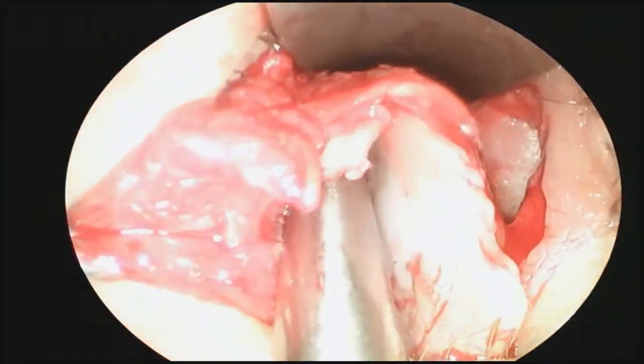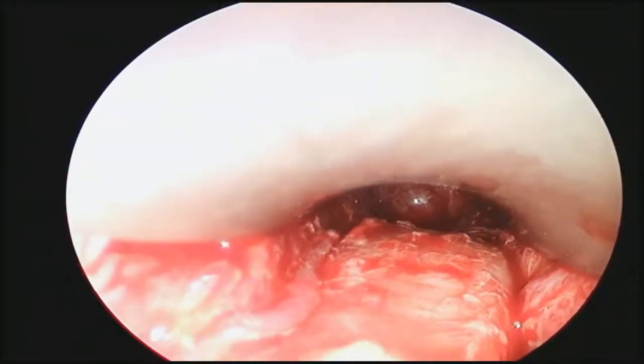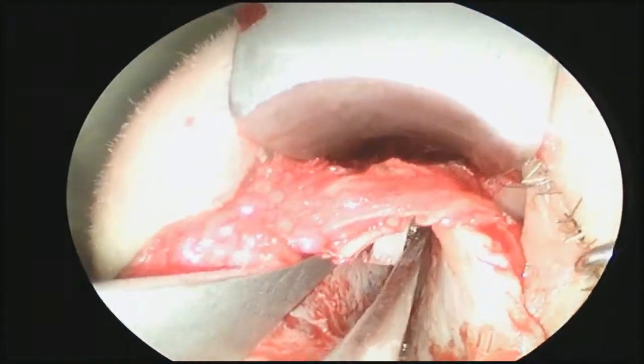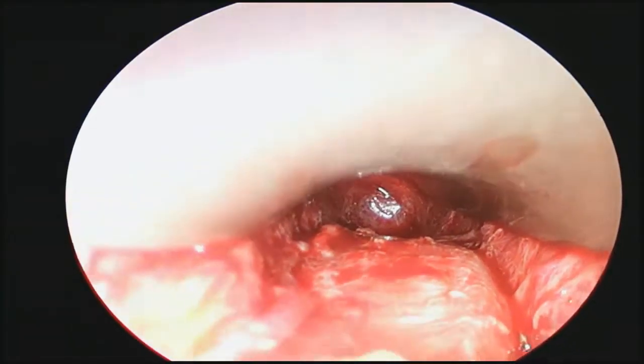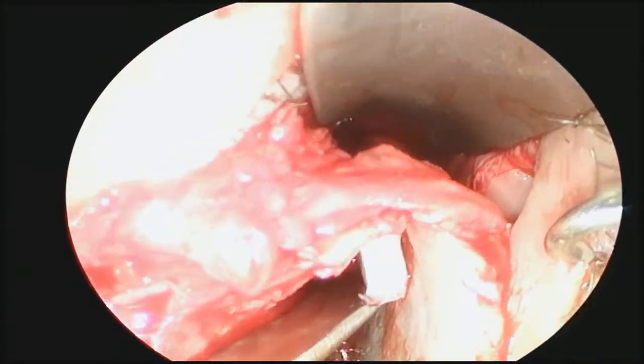We elevate the right mucoperichondrial flap up to the extreme dorsal edge of the septum with a suction freer. We attempt to position the spreader graft under the intact cartilaginous middle vault. Despite forcefully lifting the graft with the freer, we are not able to create the desired change in the middle vault. Furthermore, we are not able to confirm the position of the spreader graft cephalically.